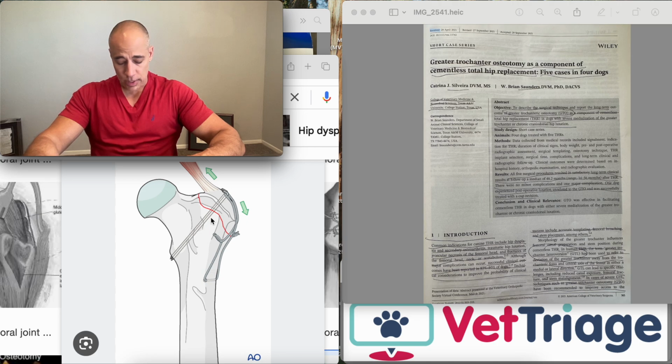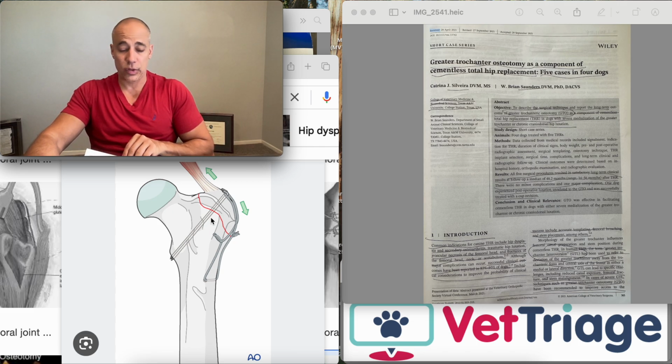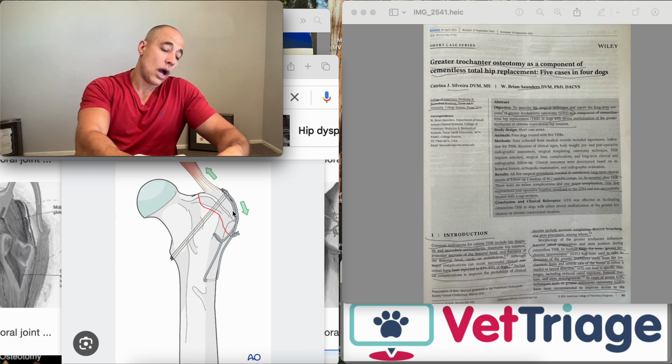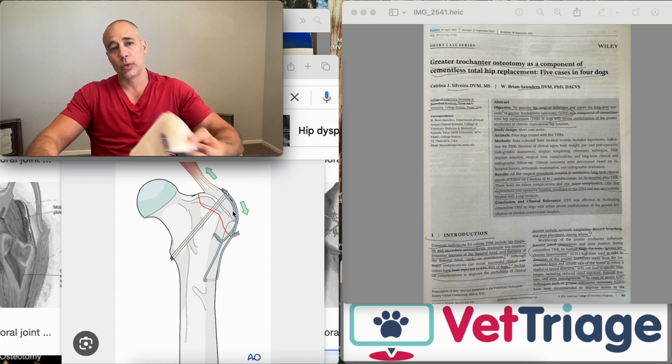So with solid bone like this, it's no surprise that a non-union, meaning the bones never heal, is the largest complication risk. The osteotomy has been associated with a reduced risk of prosthesis luxation in humans with total hip by providing additional gluteal tension through trochanteric distalization and by preservation of gluteal tendons during broaching. So that's cool. Even this procedure actually prevents hip luxation after surgery, which is also a common complication in dogs. So yeah, it's a cool case series. Obviously, they comment also they need more cases to improve the study, but that's pretty cool. I have never seen that before.